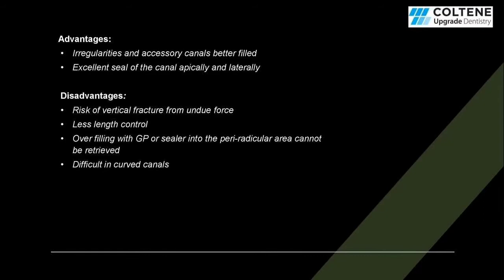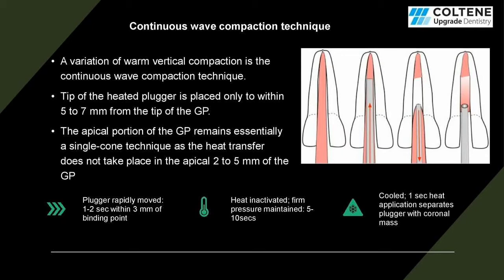Moving on, we have the continuous wave compaction technique. This is a modification of warm vertical compaction. Here the procedure remains basically the same with a slight difference. It will be clear in the video that I have in the next slide. So let's move on to it.